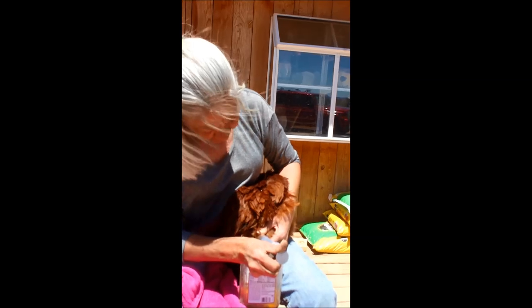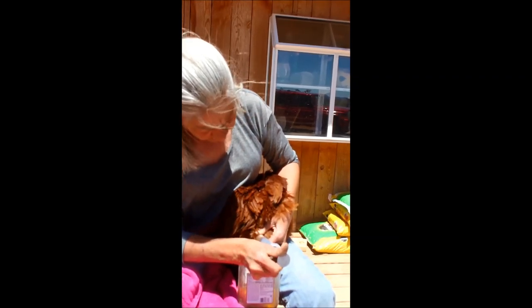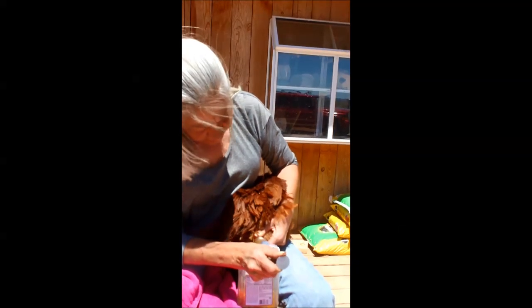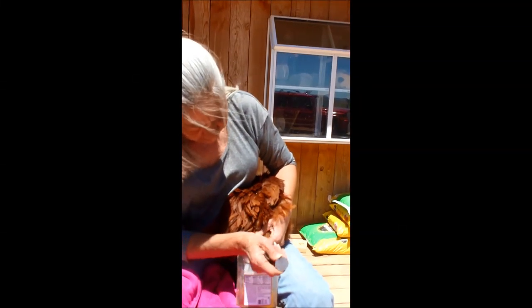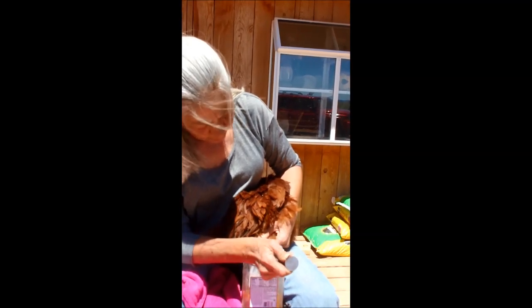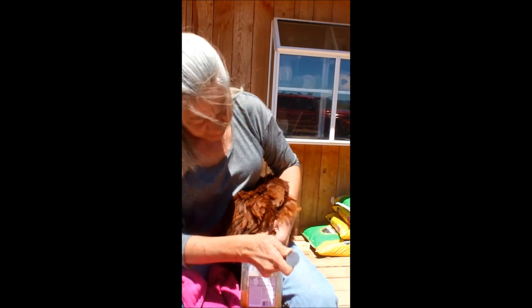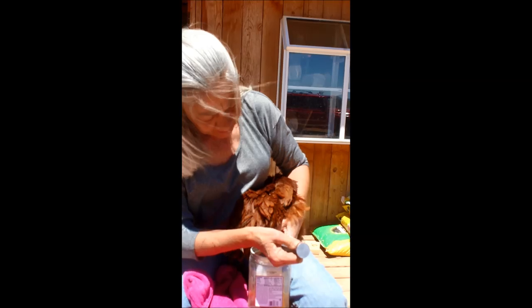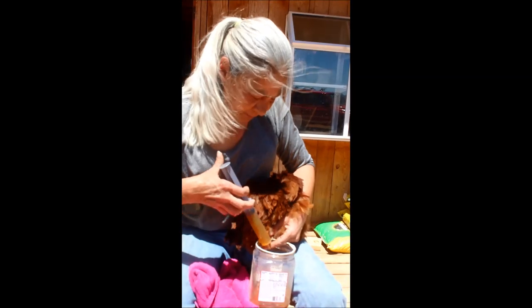This is better really if you have 2 people. That way you've got one person to hold the bird, and these syringes are really tight. They're hard to draw. But my second person is being my cameraman. I think he gets behind the camera and closes his eyes. Disconnect that from the needle again.